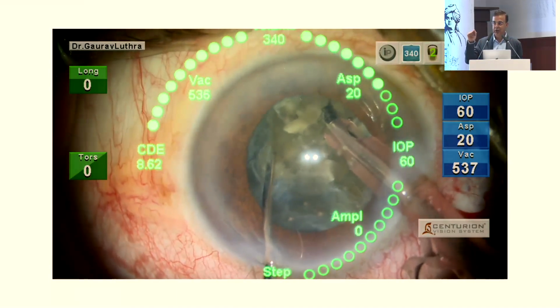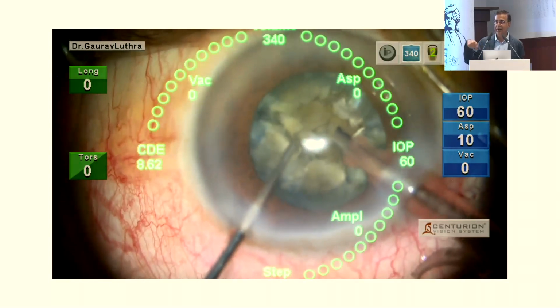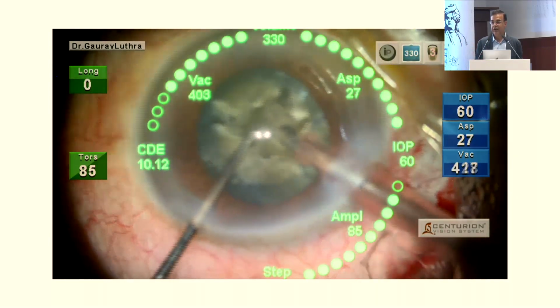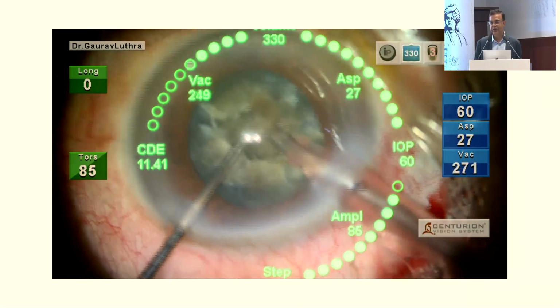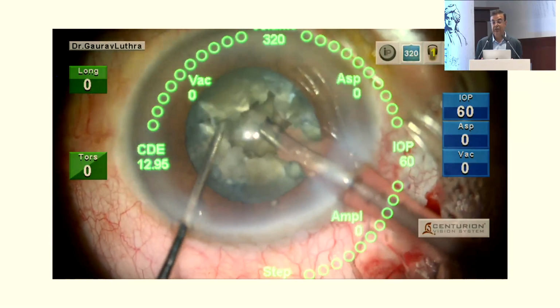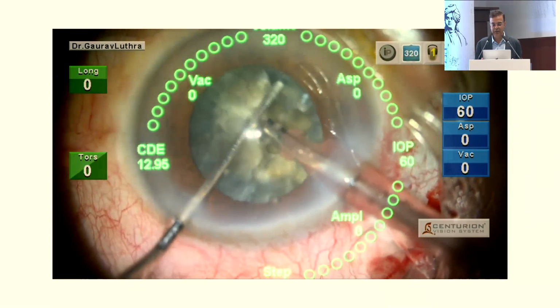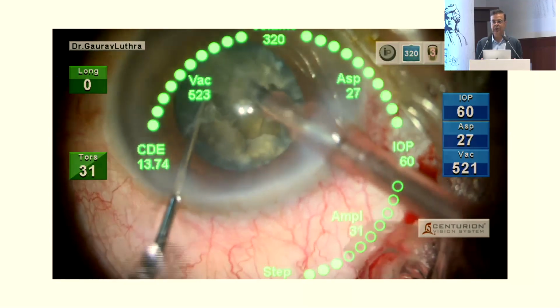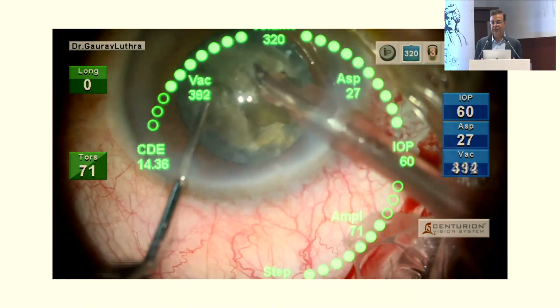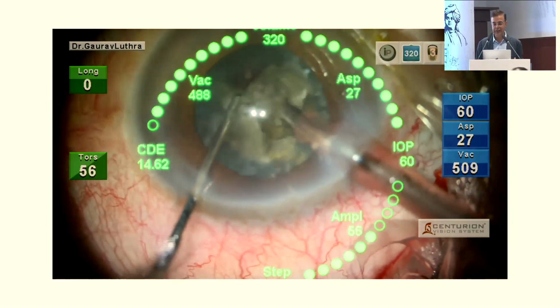Either you'll have a small notch on the rhexis, or you'll have completed the rhexis from one way or the other, or you'll have some fibrotic band. If you do lateral separation or maneuvers, you have to keep away from those areas and not let forces transmit to that place. Otherwise, the rhexis will usually give way from those areas, and then you'll be in a situation. And sometimes if you have a small rhexis, it's a good idea to give a small nick and enlarge it anyway, because trying to proceed with a very hard cataract with a smallish rhexis, you will eventually put forces on the rhexis.